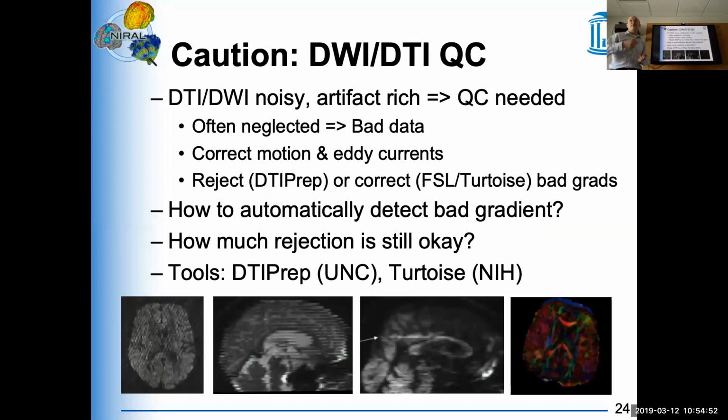That information is probably something people have to start looking at when they do this new type of FSL analysis. It also points you towards the fact that you may want to not just look at the tensor, or whichever fiber model you're fitting locally, but actually look at the raw data.